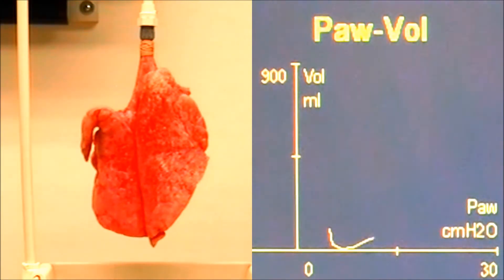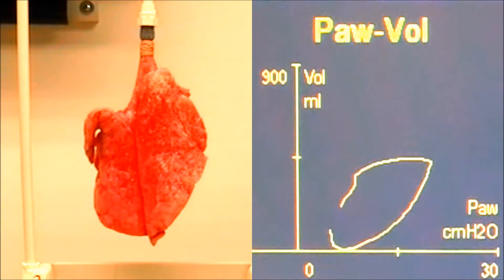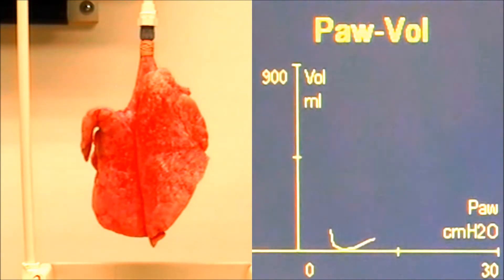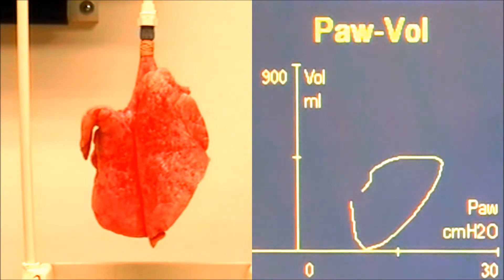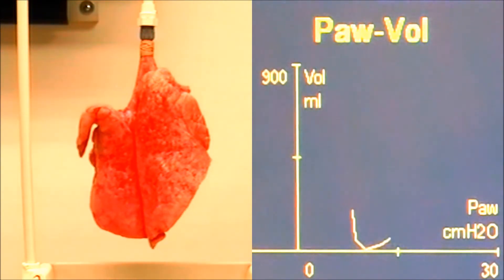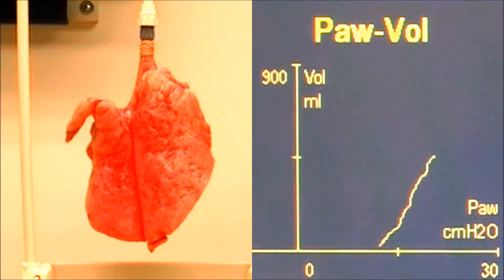The first thing I'm going to do is turn my PEEP up to eight. I'm going to switch over to my bag, turn my APL valve to slightly above 30 to around the 40 range. 30 to 40 is where you're targeting with your sustained recruitment breath. I'll switch over and keep an eye on my lungs as I do this.